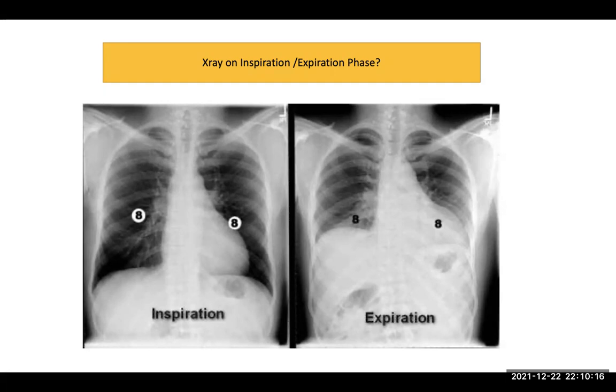So most of the technicians in our country, and in other countries like ours, don't have the proper knowledge to do a good X-ray. So you have to look at whether this X-ray is in the inspiration phase, which is what should be done, or in the expiration phase.